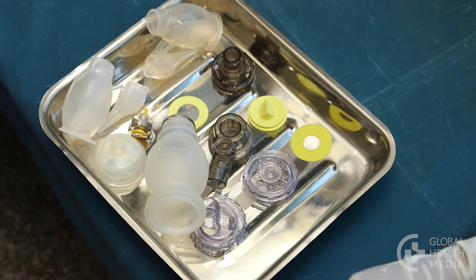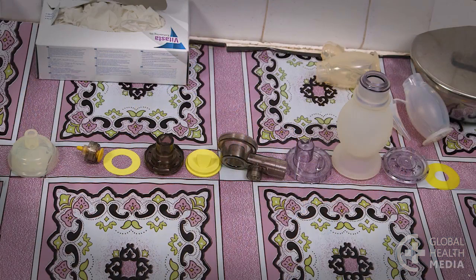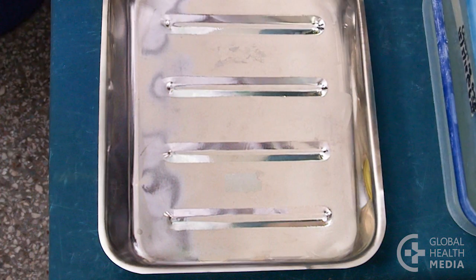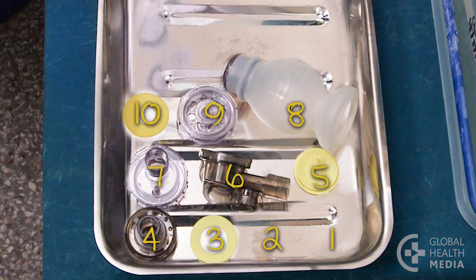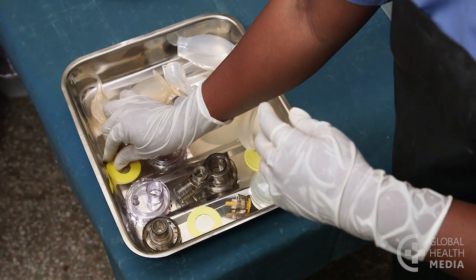Next, put the bag back together. Here's one way. Remember the order you took them apart. Then, line up the pieces in the opposite order. Start with the last piece.